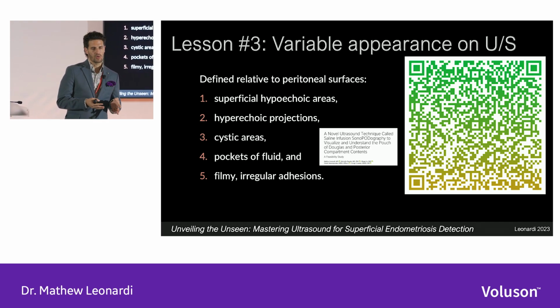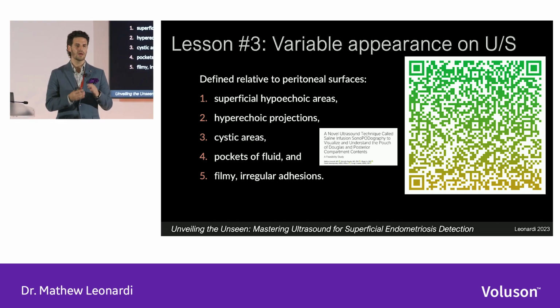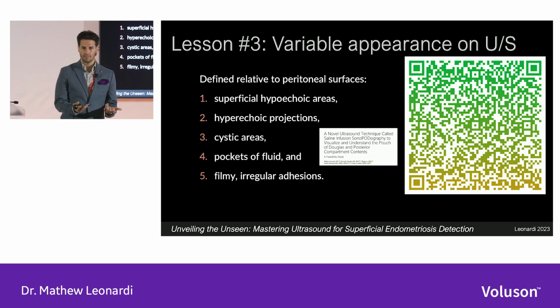For those of you here who perform sonohysterography or HyCoSy ultrasound tests, this is going to be a very easy technique to adapt because it really is the next step following infusion of saline into the uterus when the fallopian tubes are patent. The fluid will traverse through the tubes, and based on the dependent nature of the pelvis, it will settle into the pouch.